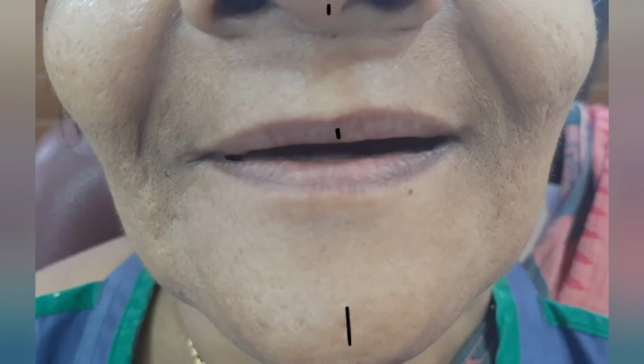It's because this tutorial is mainly focused on clinical tips to make a complete denture or a removable partial denture, remembering the anatomical reference points so that we will be able to fabricate a better prosthesis that is harmonious with the patient's oral dynamics. First, let us see a complete denture patient.